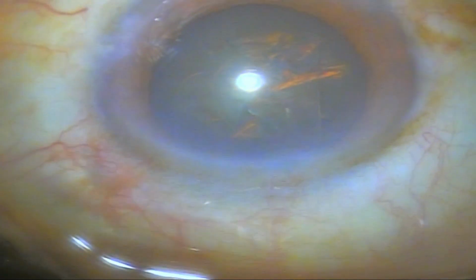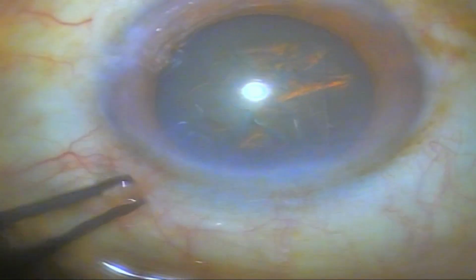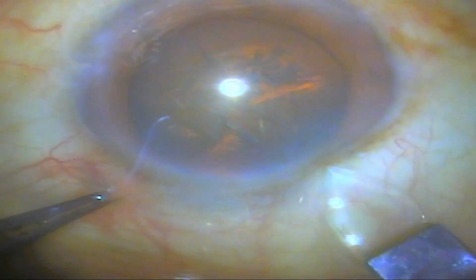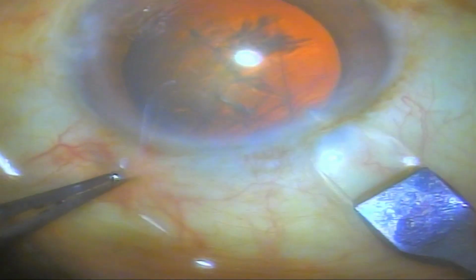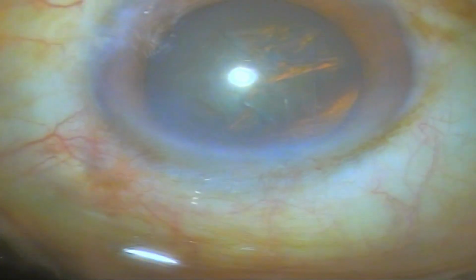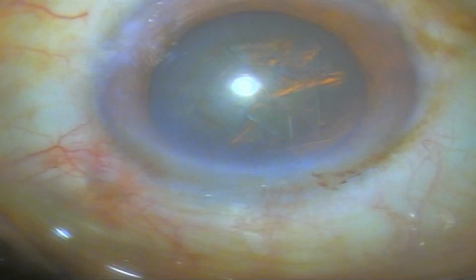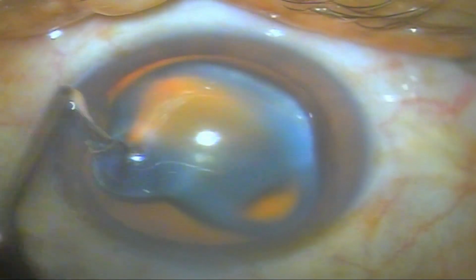In this video we can see very clearly that the triangular part of the anterior capsule is plugged up, and then we use the 2.7 millimeter diamond knife and make a full thickness corneal incision very comfortably. This is another case.